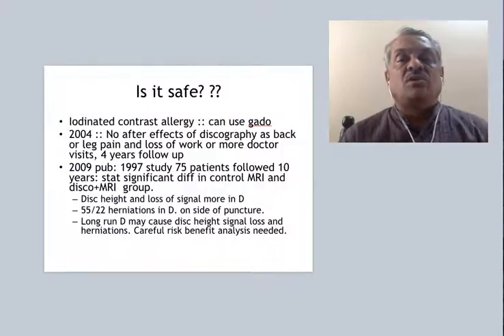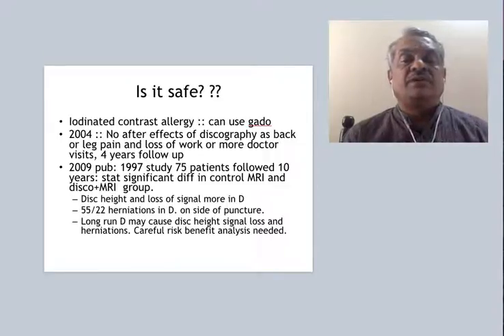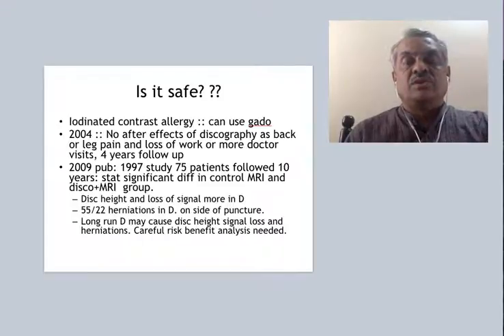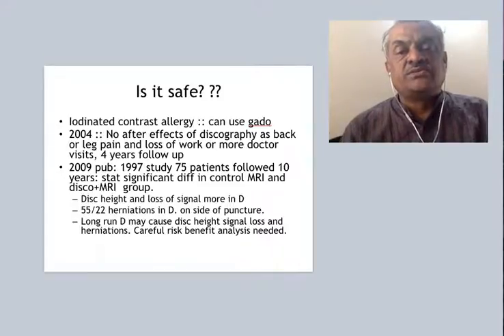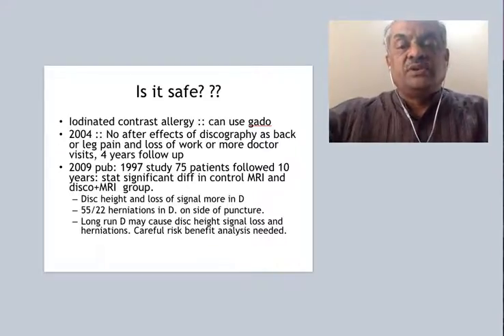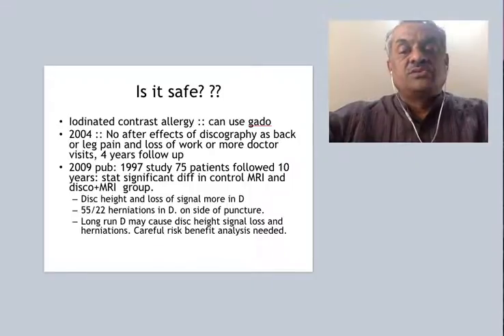Now, there have been a lot of questions about the safety of the act and the utility and the content of the discogram. We have been using iodinated contrast, and there are some people who react to the iodine content because they have an allergy to iodine, in which case we should go in for use of gadolinium. A study in 2004 has concluded that no after effects of the discography, such as back pain or leg pain or loss of work and more doctor visits, are seen with a 4-year follow-up up to 2008.